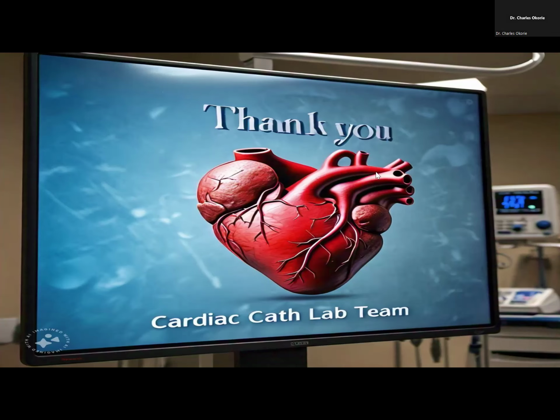I wanted to make some contributions on, number one, the access. Like we said, radial is now preferred, although most centers still use the femoral. But when it comes to interventional procedures, most people will prefer the femoral. This is because radial access cannot really take more than a 6 French sheath, like Dr. Conte said. Most people will use a 5 French in radial access.